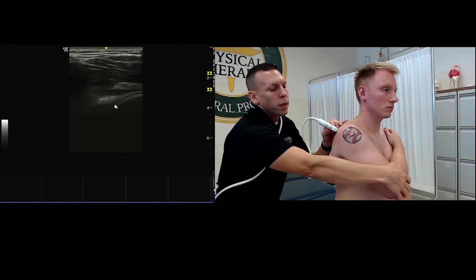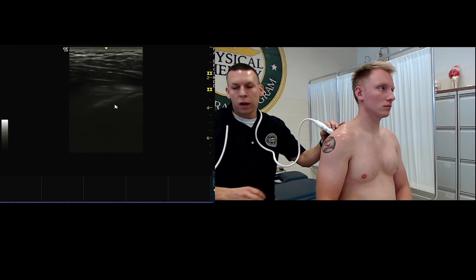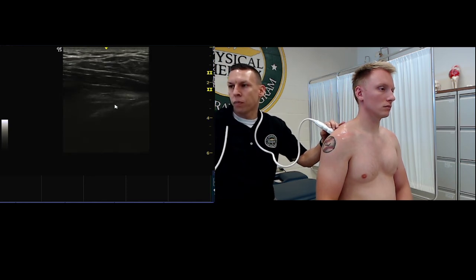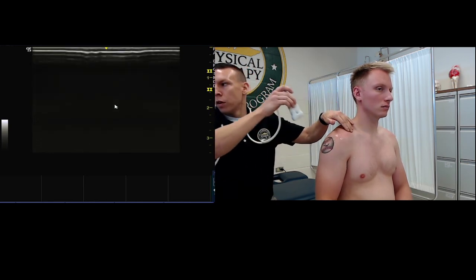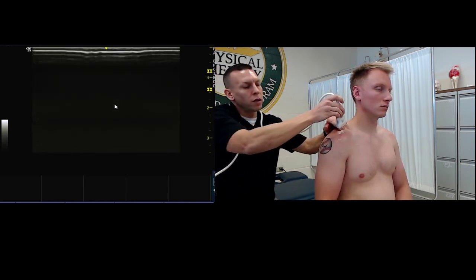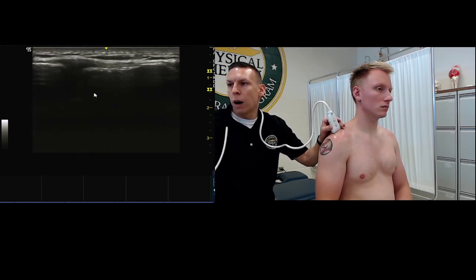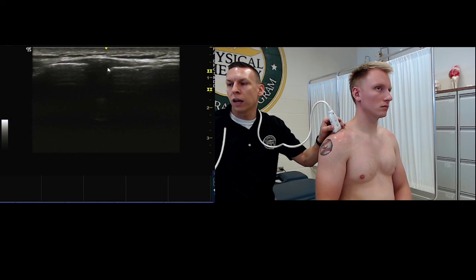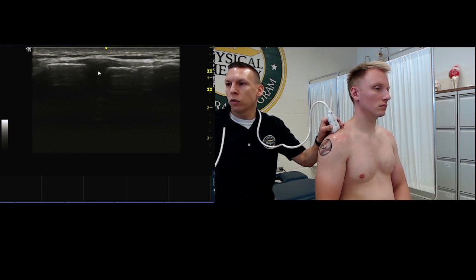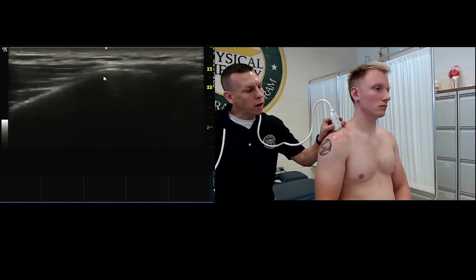All right. The last thing we're going to take a look at in the shoulder is the AC joint. Now this is a much more superficial structure, so we're going to change our depth. And we're going to take our probe. You can just palpate the AC joint if you'd like and put the probe right on top. I do find this can be a difficult joint to identify, so an easy way to find it is to locate one of these two bones.